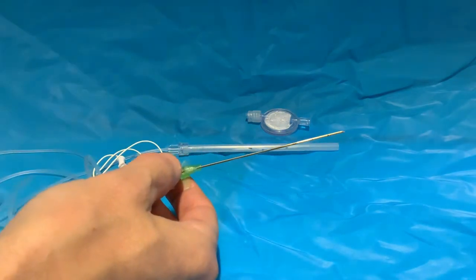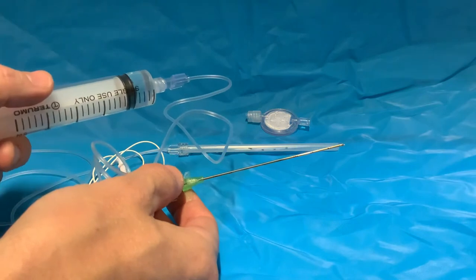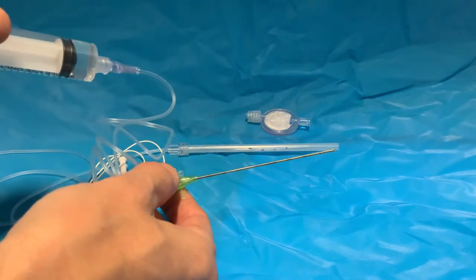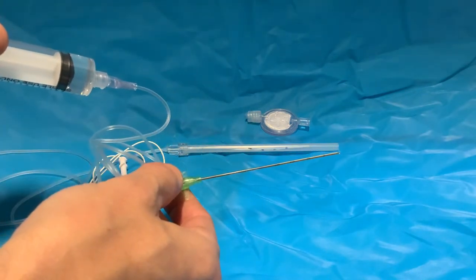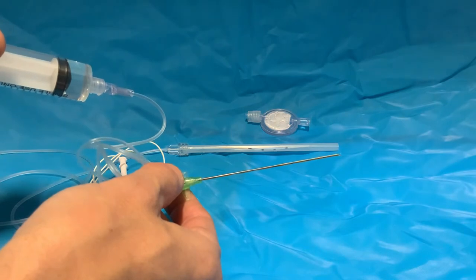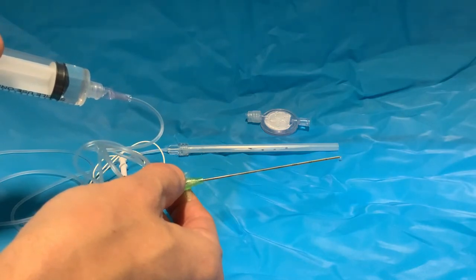Before you start, you should flush with saline or local anesthetic to put local anesthetic along and inside the cannula. It will help it to be more echogenic when you start.